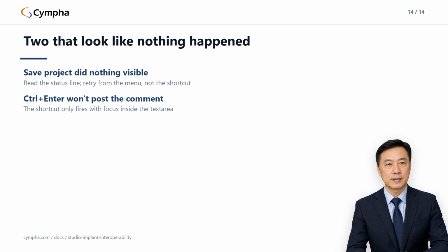Everything here is written out in full, dialogues, formats, and every failure mode, at cympha.com. Open Docs and find the guide on round-tripping an implant case between Cympha Studio and Guide Mia implant software.